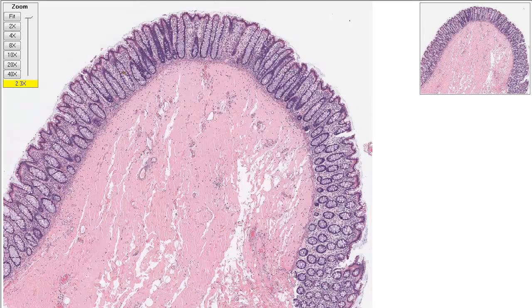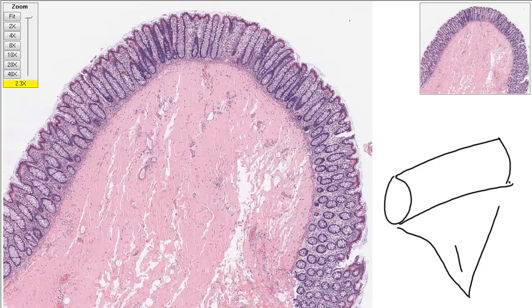Cool. Yeah, this looks neat. What is this? So what we're going to be looking at today is the histology of the colon. And so for the colon, we often have colon specimens come to me in pathology. I'm a pathologist. I see. Right. And so the colon, like we were saying before, is the large intestine. And so if you have this piece of large intestine, often it's removed from the patient because there's an area of cancer. Or something that might be cancer. They don't know. Something that might be cancer.